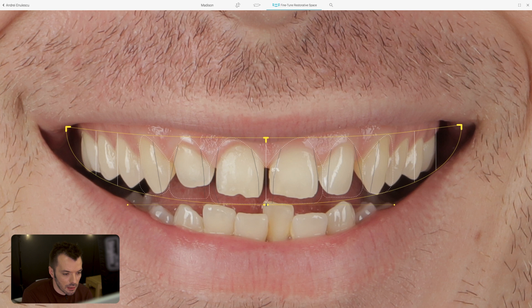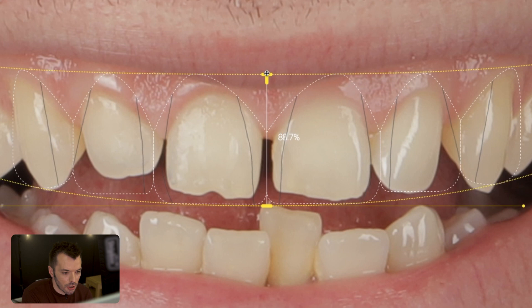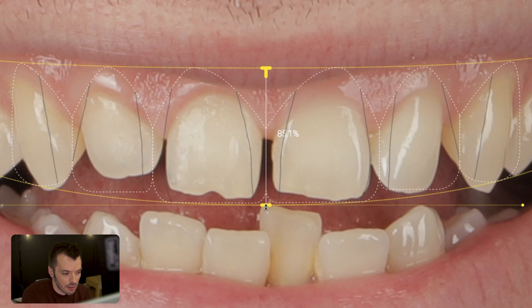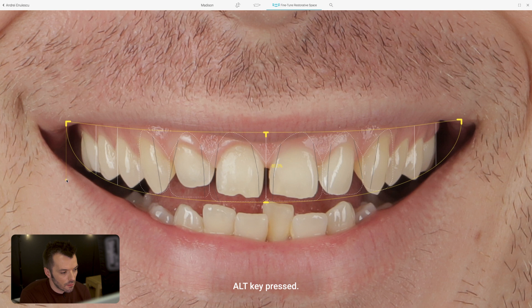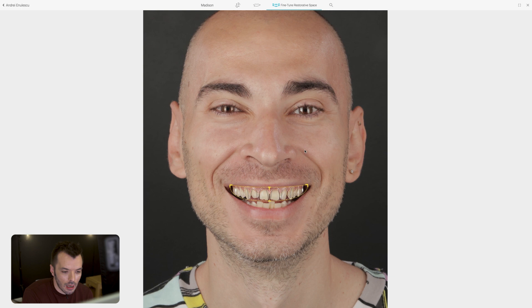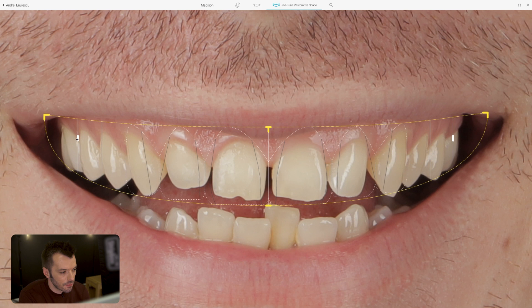Right now this looks too squarish, so I go in and change it. Moving the central point moves the grid completely — I'll move it to simulate a little bit of crown lengthening and then re-adjust the curve amplitude. For finer tuning, I can adjust proportions with the ALT key, either symmetrically or asymmetrically. I usually look at the canine area when doing this — you can always move the teeth around one by one afterward, so just try to match the canine to an acceptable position.